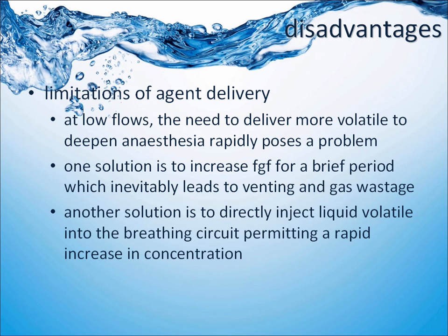There are limitations of our vaporizers. For example, when you're maintaining a low flow anesthesia, your sevoflurane vaporizer may be set at about 5% with a flow of 1 litre per minute, just to maintain the desired MAC of about 1 or 1.1.